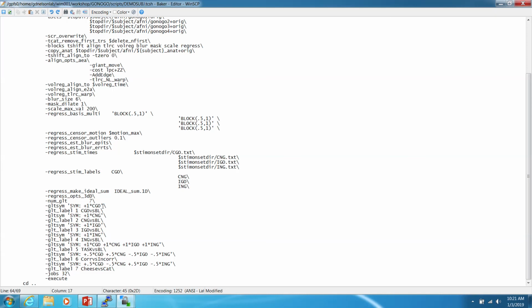So this ends up coding for all of these different comparisons. You'll notice when we're comparing two different conditions, and it's not just the implicit baseline, you code some as positive and some as negative, and that just sets up our comparison. This works just the same as regular linear regression, however you want to load things when you're doing contrasts.